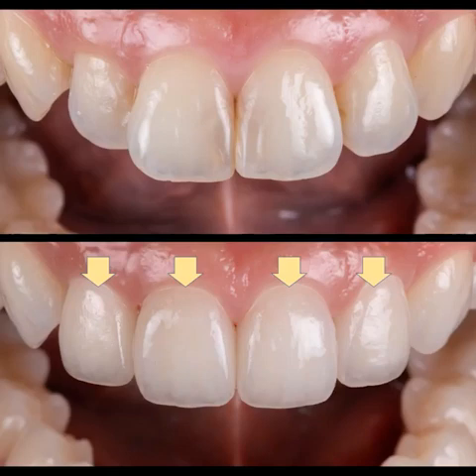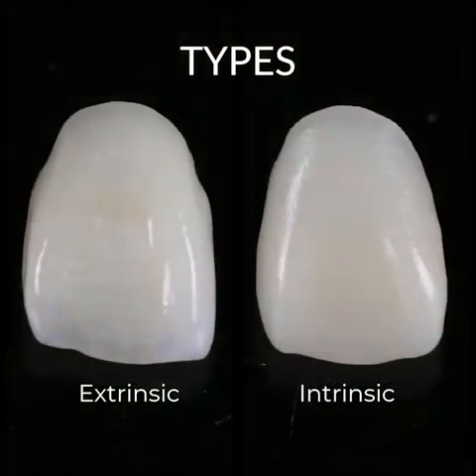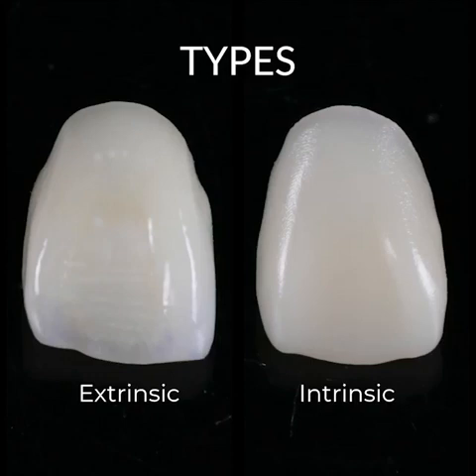But whether the ceramic has high or low translucency, for anterior restorations, you almost always need to have both extrinsic and intrinsic translucencies working in tandem to achieve aesthetic results. In essence, it's a color gradient and some highlights, staining and glazing.